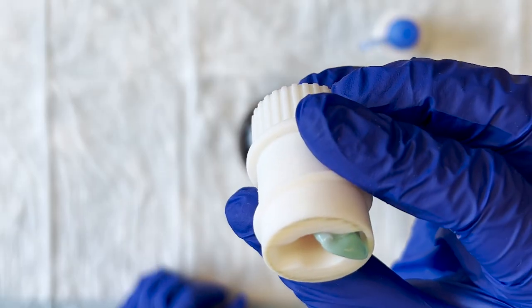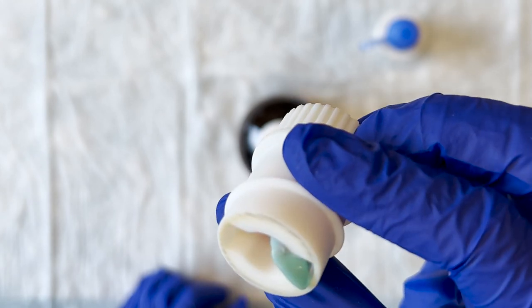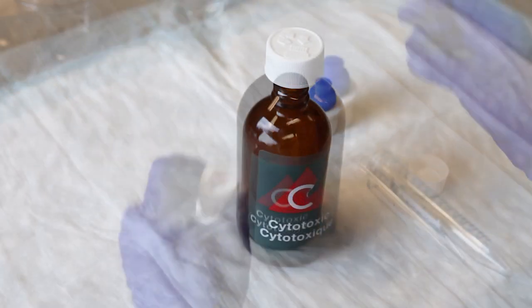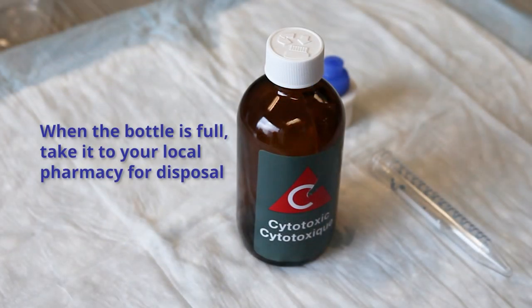Pieces of the capsule may also be left in the capsule shredder. Dispose of these pieces in your medicine bottle as well. When the bottle is full, you can take it to your local pharmacy to dispose of it properly.